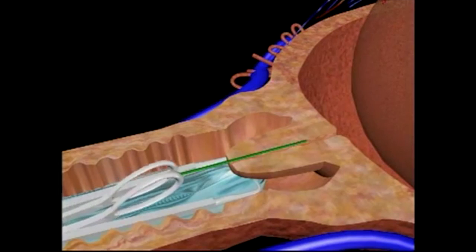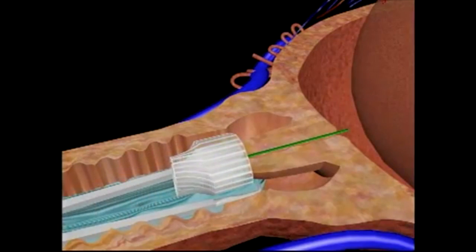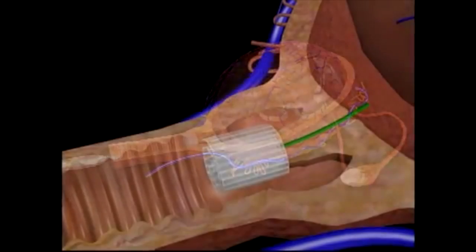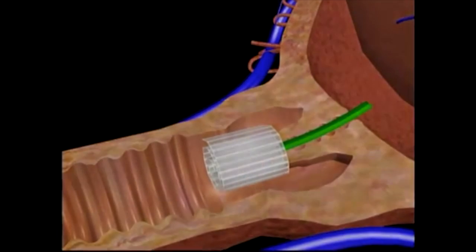Once that's done, forceps are used to insert the laminaria and place gauze over the mouth of the cervix. The tenaculum is then released and the speculum is removed. As the laminaria absorbs moisture from the cervix, it expands and dilates the cervical opening. This process generally takes several hours to complete, but in the case of very late-term procedures, it can take 2 or 3 days. In some instances, subsequent laminaria installations are required in order to achieve the necessary dilation.